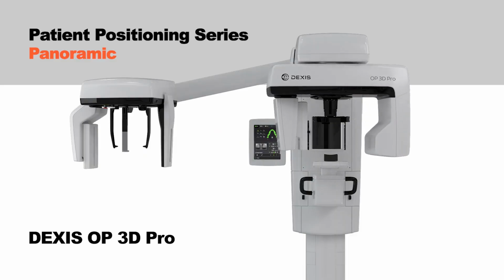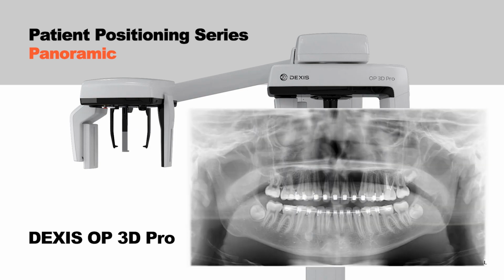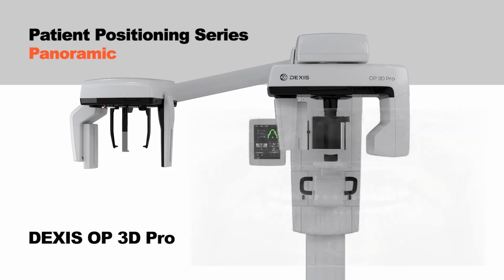Hello and welcome to a DEXIS OP3D Pro clinical training video for acquiring panoramic images. This video covers patient positioning, projection selections, and acquiring the image. You can select a specific topic using the Seek bar on this video. For an overview of the DEXIS OP3D Pro hardware and its components, click the thumbnail at the top right corner of this video.